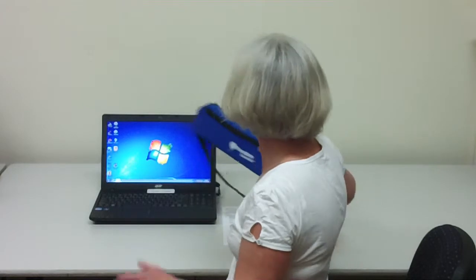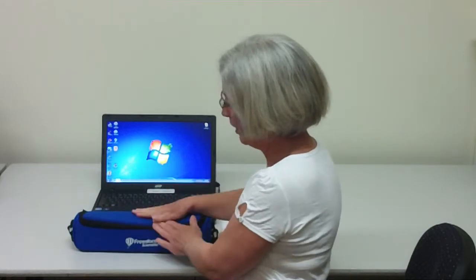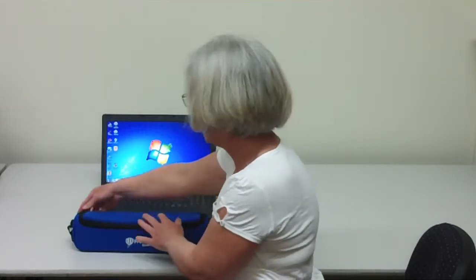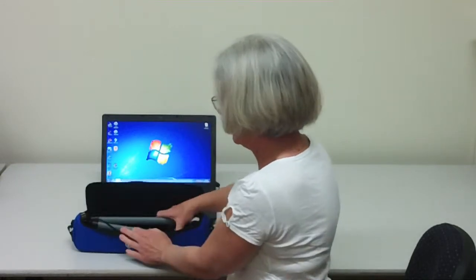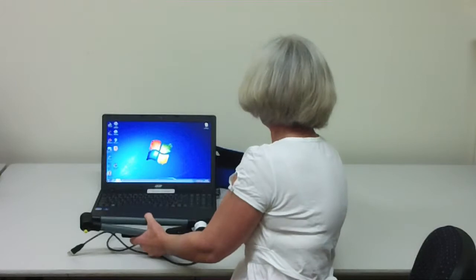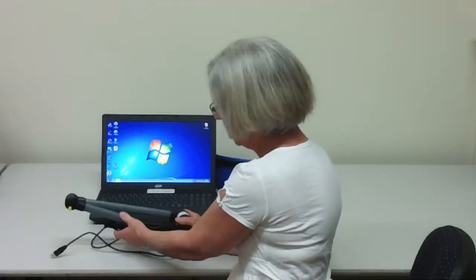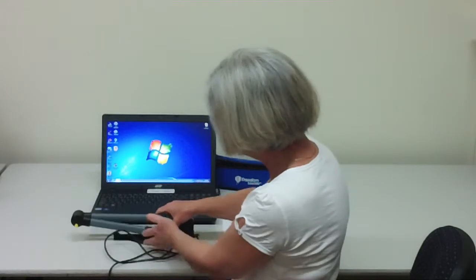Now we're ready to get the camera out. The student needs to practise unpacking this for themselves. Put the camera down on the table for stability and unzip. Take it out. Think about where the case is going to go because the student needs to be able to find it again later. Place the camera down on the table with the base on the table.